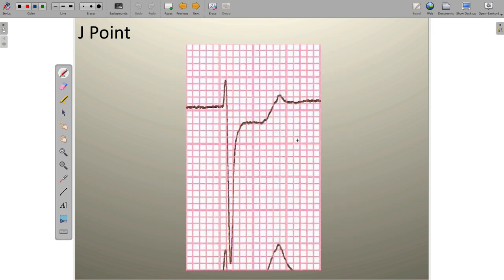Let's do one last example. The J point in this example is right about here. That signifies the end of ventricular depolarization to the left, and everything to the right of that point is ventricular repolarization. Being able to find the J point is critically important because we're going to next evaluate the location of that J point against other elements on the EKG trace.